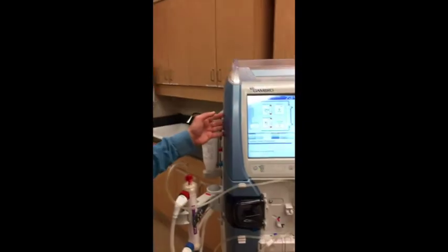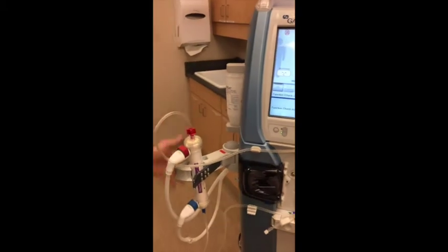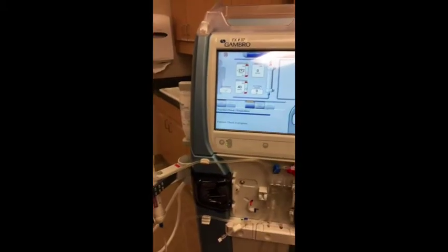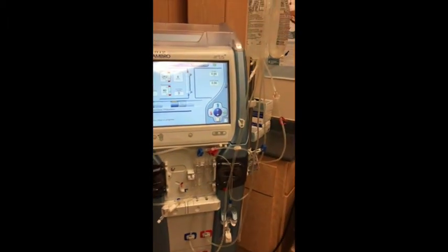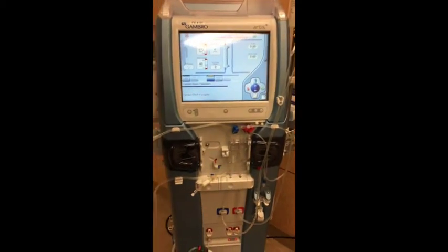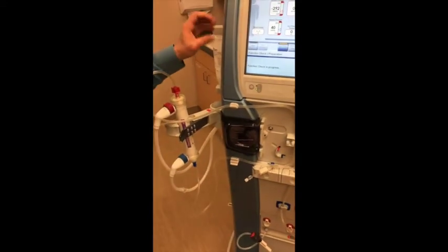What we have here is the Gambro ArtIS — now owned by Baxter — ArtIS Dialysis Machine. As you can see it's all tubed up and it's preparing for dialysis here. This machine is used to dialyze the patient approximately three times a week, three to four hours, forever and ever until they get a transplant.